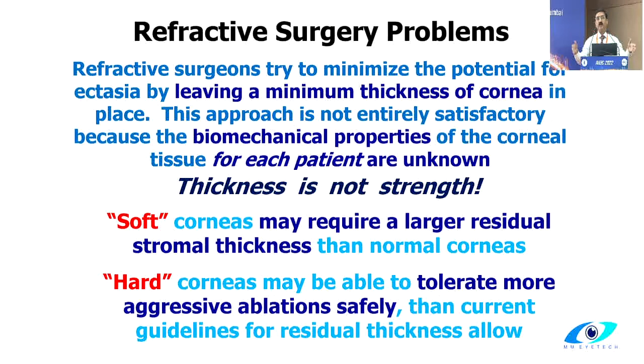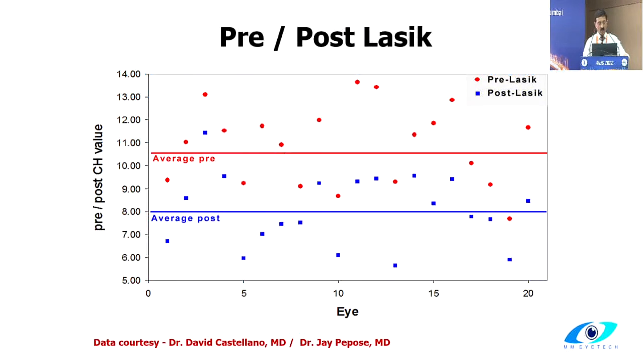So even though we reduced the zone size and did everything else to try and reduce the amount of ablation, that is a matter of fact. And I'm sure people who started LASIK going back into the mid-90s will all have anecdotal experiences of patients who we did with high double digits of myopia ablations and got away with it. Luck.